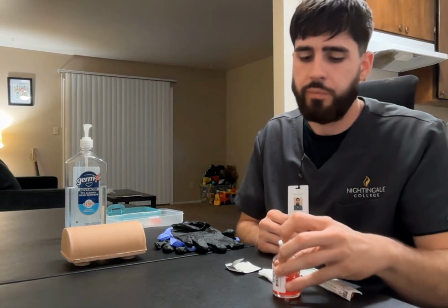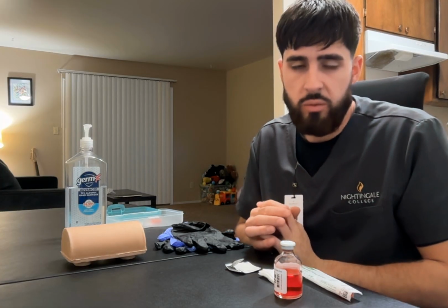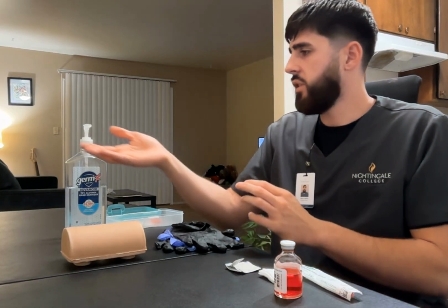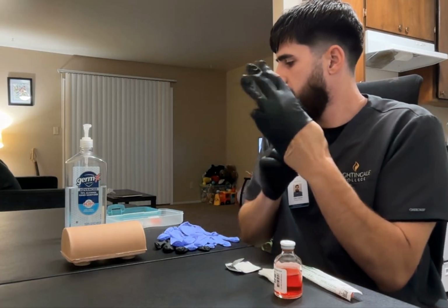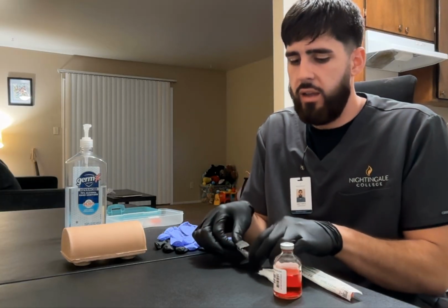Now I'm going to deal with my drug. I'm going to have Mr. Smith's MAR open and again recheck that I have the correct drug up to the MAR. With that being said, I'm going to start to prepare the injection by loading my syringe with the drug. When doing so, I'm of course going to perform hand hygiene, don a set of clean gloves, remove the lid off my medication. I'm going to open an alcohol prep pad.